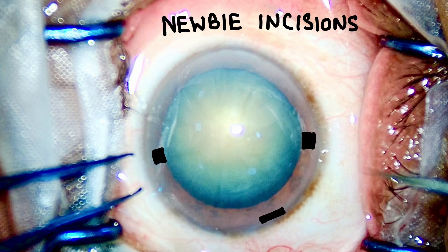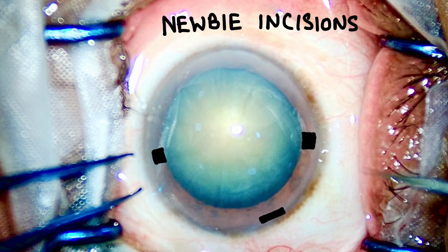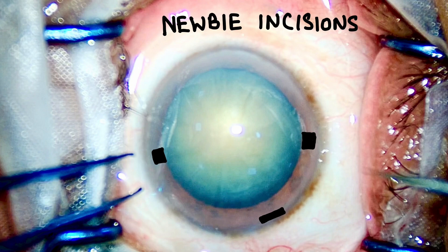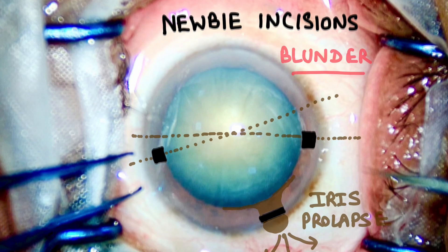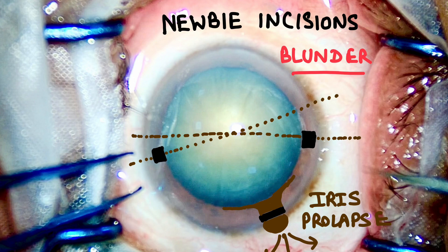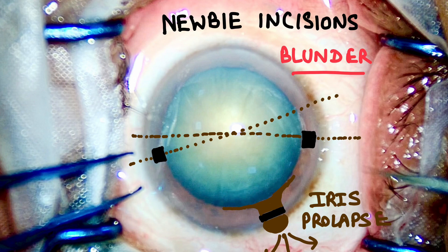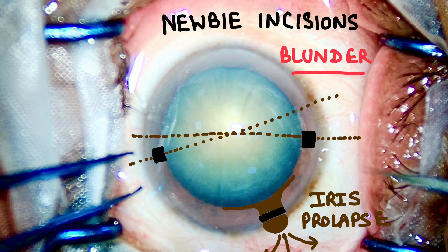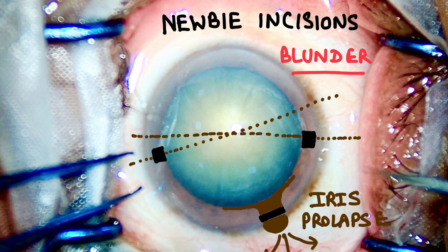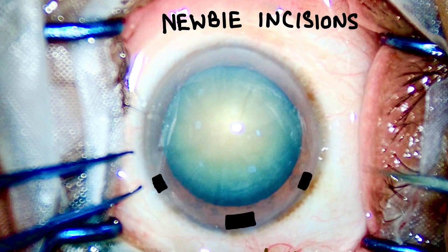Every case is different and we will first discuss the most common mistakes new surgeons and residents make, and then in the second part of the video demonstrate how a pro surgeon operates, minimizing these mistakes and giving beautiful results. In this first case, you can see the new surgeon has created ill-formed side ports that are not straight and a very short tunnel length main port. Because of the mal-aligned side ports and shorter tunnel length, as vitreous pressure increases, there is a high risk of iris prolapse, which makes surgery very difficult, increases post-operative inflammation, IOP spikes, and intra-operative complications. Never ever create a shorter tunnel length.